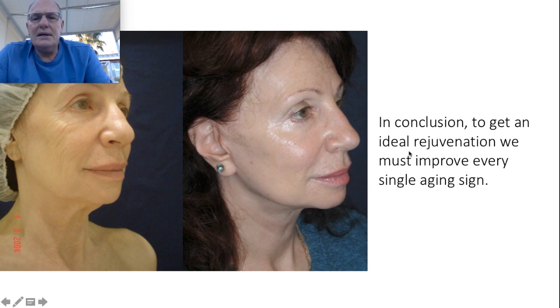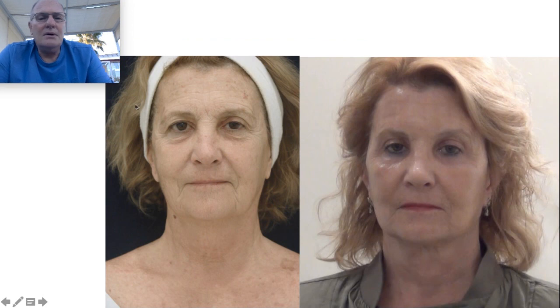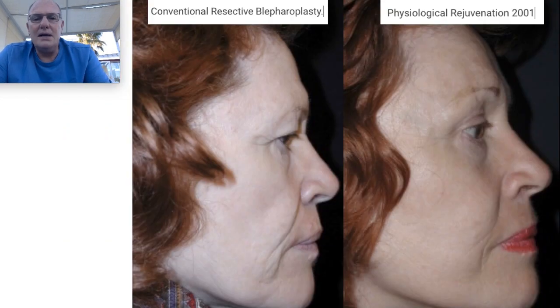In conclusion, to get an ideal rejuvenation, we must improve every single aging sign. What that means is, in the upper eyelid, I perform laser, in the periorbital laser, and I reposition the tail of the eyebrow. And here is a combination of the techniques. From here to here, I do not remove skin, I do not leave a scar. Always have natural results because I do not remove skin. It is impossible. You can see the change of the look, how I tighten and improve also the skin with laser.